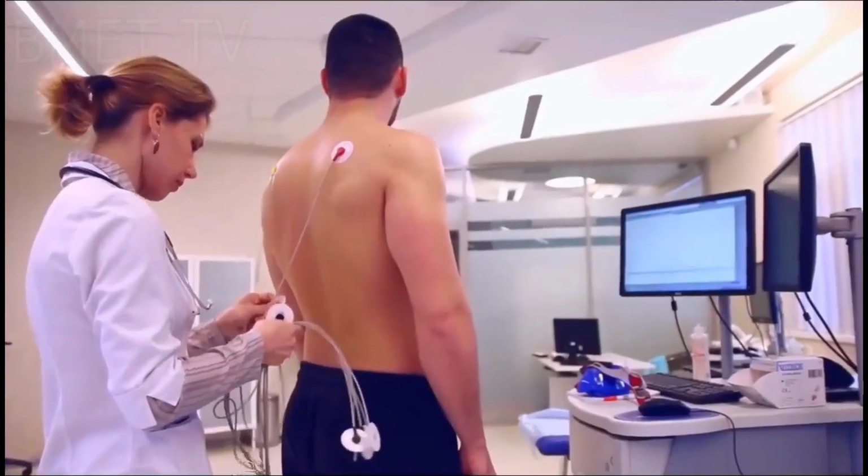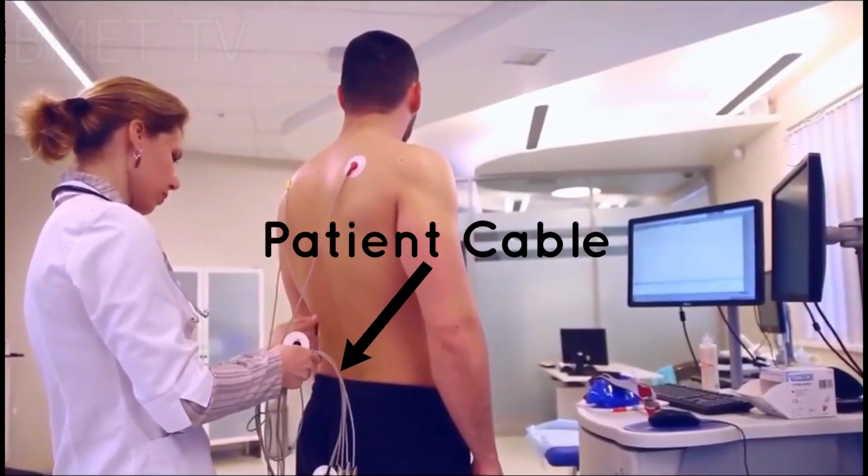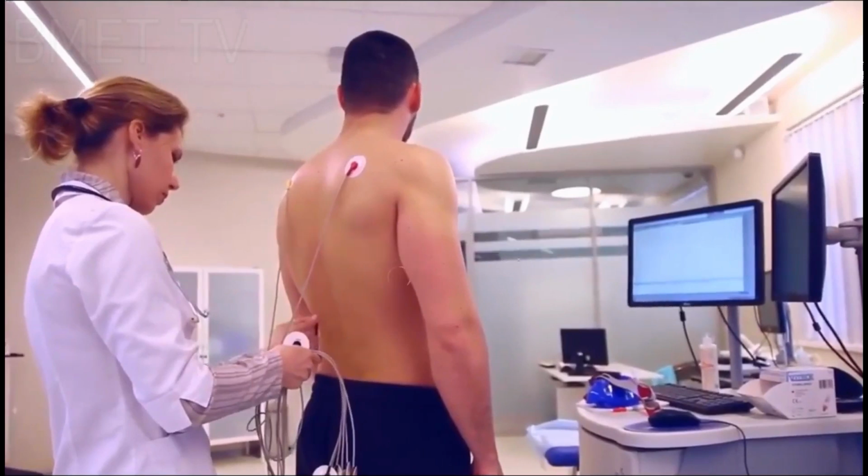The third component is the patient cable. Patient cable is also known as ECG cable, which interfaces between electrodes and machine, and carries the electrical impulses to the machine CPU board to analyze and display the ECG complex.